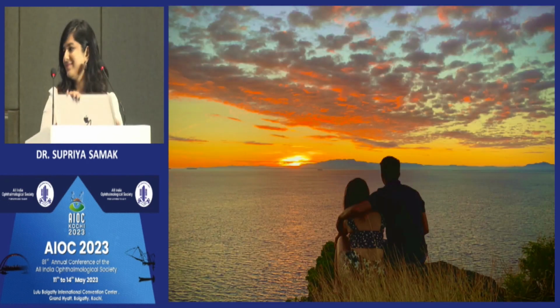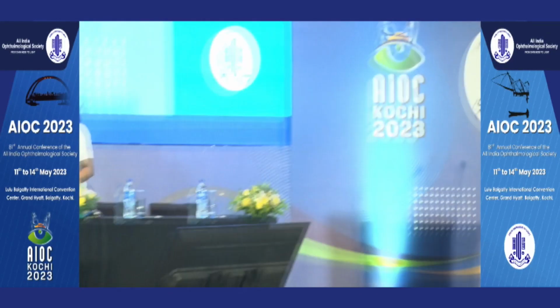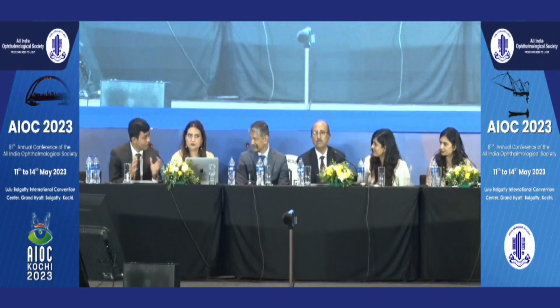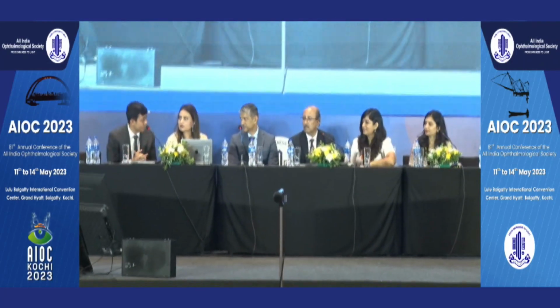Great set of videos, Dr. Supriya, and really covered an entire gamut of cases. Just one thought from the panelists. She was showing, maybe sir was not there at that time, a couple of cases of IOL explantation where the periphery of the capsule is quite fibrosed. Sometimes we even get these older lenses which have opacified. I find it an easier option to cut at the optic haptic junction, leave the haptics inside, rather than removing them, causing dialysis. Your thoughts on that, sir?